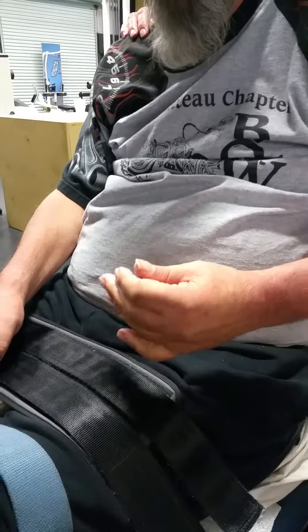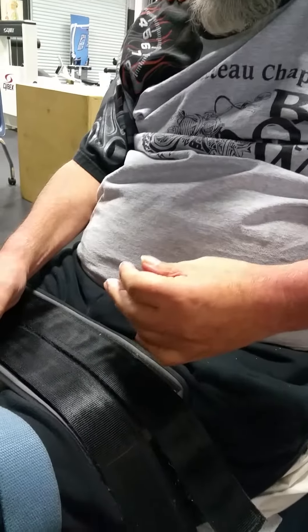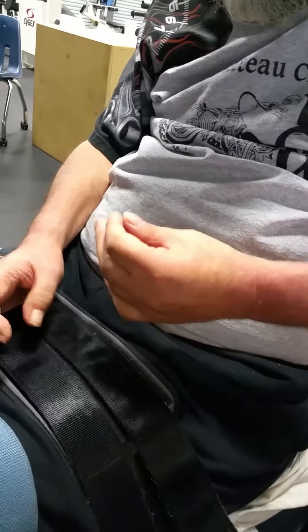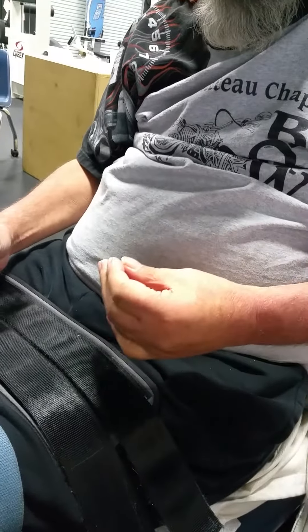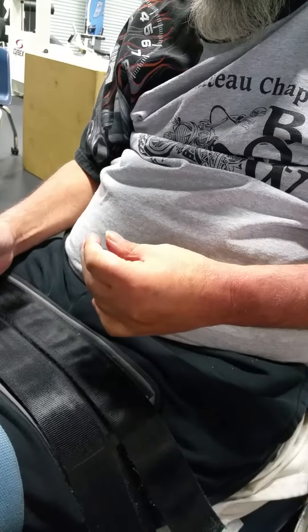Go ahead — thumb, ring, middle finger. Oh, what happened? You knew you were doing it early. There it is. That came from putting your hand on the vibration plate.